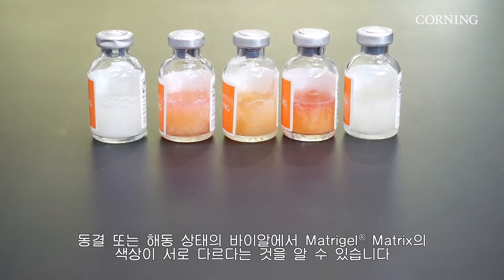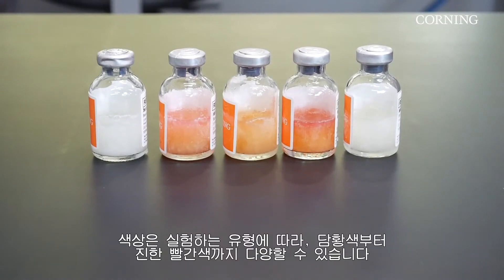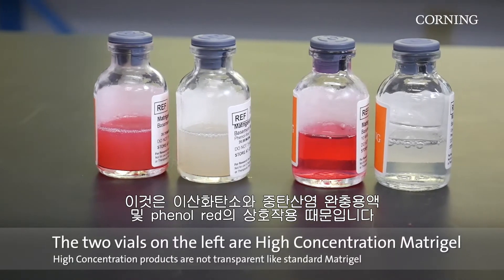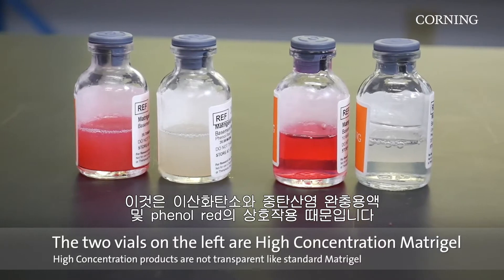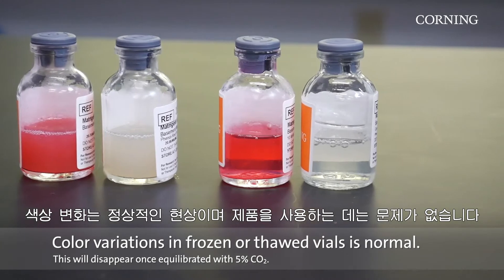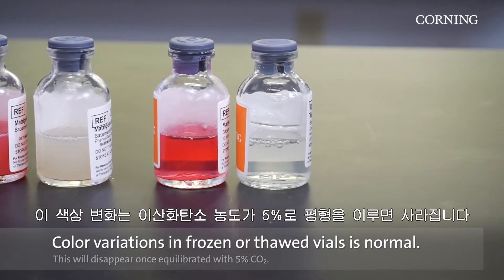You may notice that your Matrigel Matrix has color variations in frozen or thawed vials. The colors may range from straw yellow to dark red depending on the type you're working with. This is due to the interaction of carbon dioxide with the bicarbonate buffer and phenol red. Variation in color is normal and does not affect the product efficacy. This will disappear upon equilibration with 5% CO2.